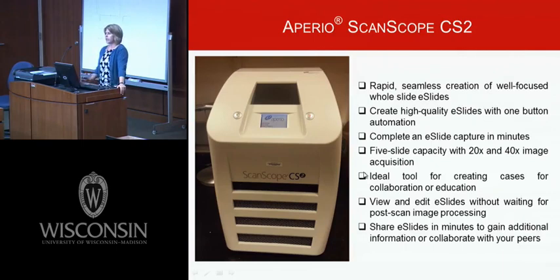So before we get into the imaging modalities, we have a new piece of equipment within the TRIP laboratory, and this is the Aperio ScanScope digital slide scanner. And so what this is, it's a rapid and seamless platform that allows you to image whole slides.